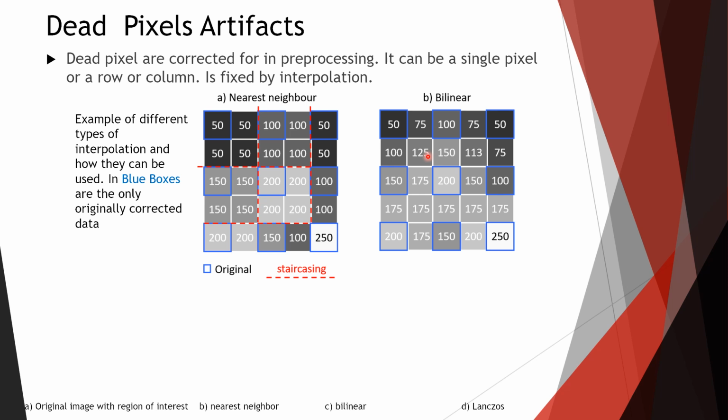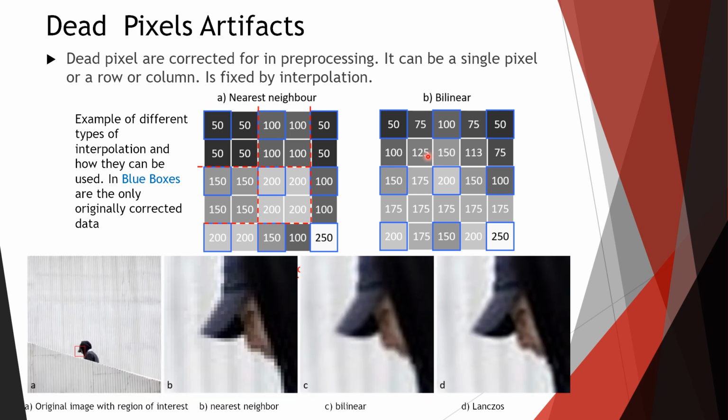We'll look at some other ways, and these become much more robust and much more complicated, and it's kind of beyond what we're interested in for our purposes, okay? But I'll show them to you here. So with the nearest neighbor, we can see that this still looks really blocky because it's taking large sections and just staircasing them off, making multiple pixels of the same value. So of course it's going to be stair-steppy, right?